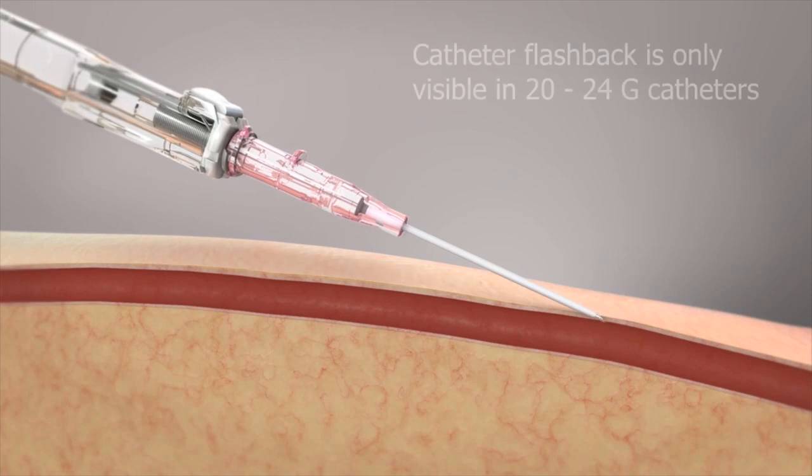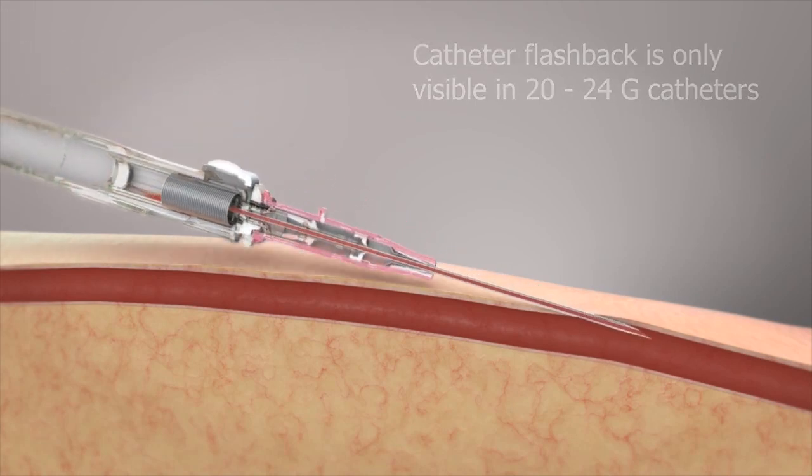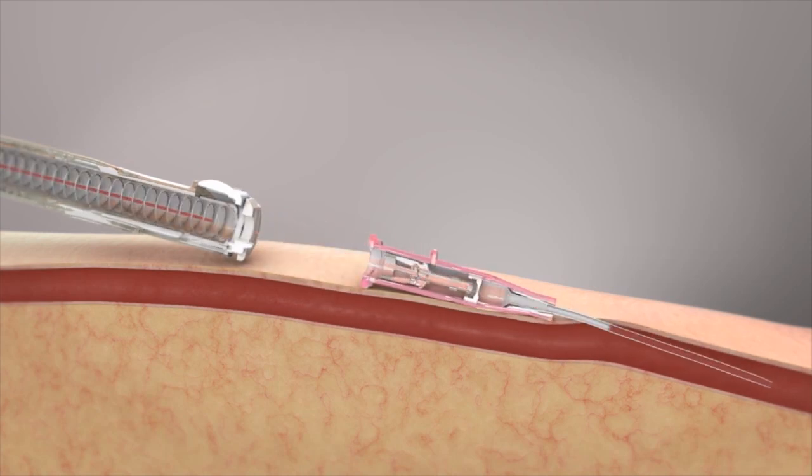The vein is penetrated and blood return is observed along the catheter shaft and continuing to the flash chamber. The catheter is then advanced and the button is pushed, retracting the needle into the barrel where the needle is fully encapsulated.